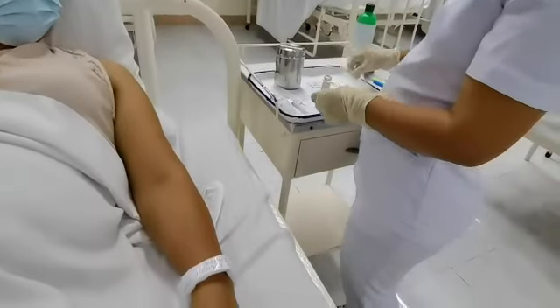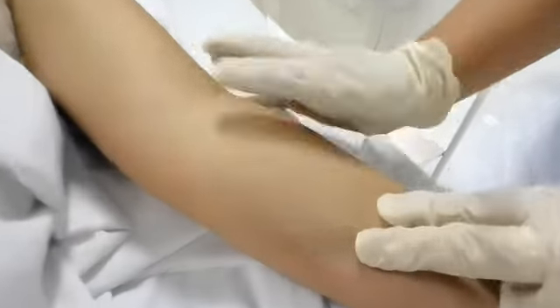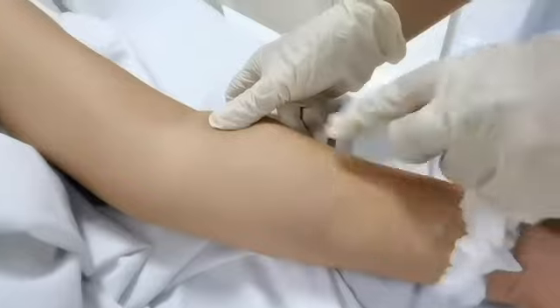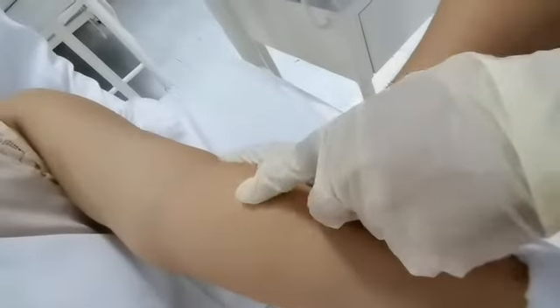So, select injection site on forearm if no other site is required by agency policy or doctor's order. Use alternative site if forearm cannot be used. Position client with forearm facing up. Cleanse site with alcohol using a circular motion starting from the center and working outward. Allow alcohol to dry. Remove needle cap.